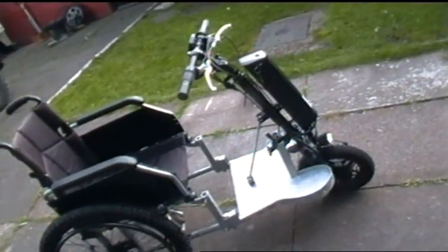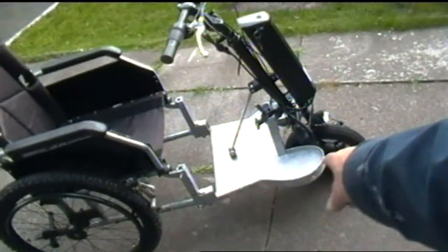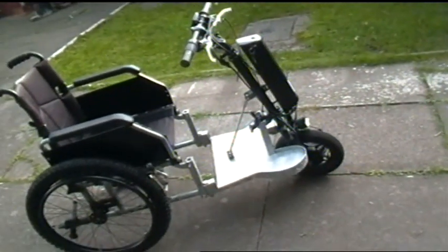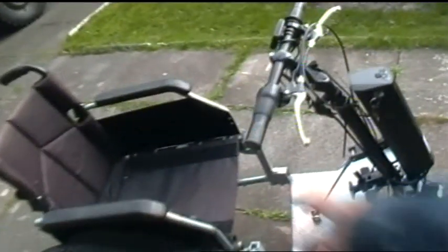So I need to give you another little demonstration of it running. It's pretty much along the lines of being finished now. I just need to put a few pop rivets to hold the checker plate down onto the frame. Maybe clean it up here and there, and it could do with a cushion putting in the seat.